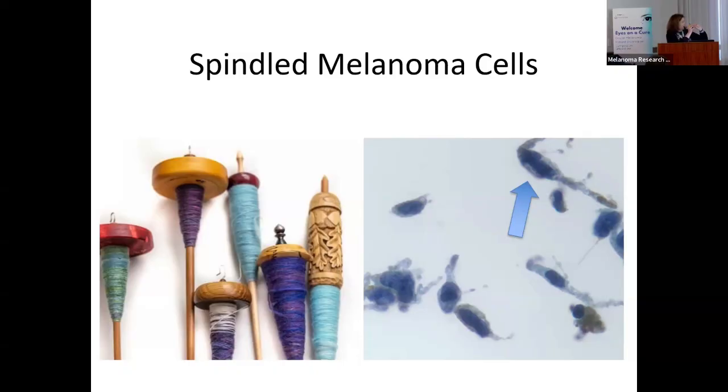Tapered end, it looks kind of like you stretched the cytoplasm. The nucleus is the blue thing in the middle, right there, right at the tip of the arrow. The cytoplasm is this skinny, tapered material at the end of the nucleus. And that's very helpful. It's also very helpful to us that we see pigment. In other tumors, there are not these brown specks. When a tumor makes pigment, that's a clue to us that it is a melanoma.